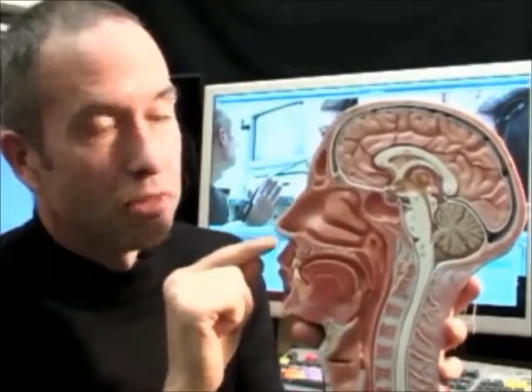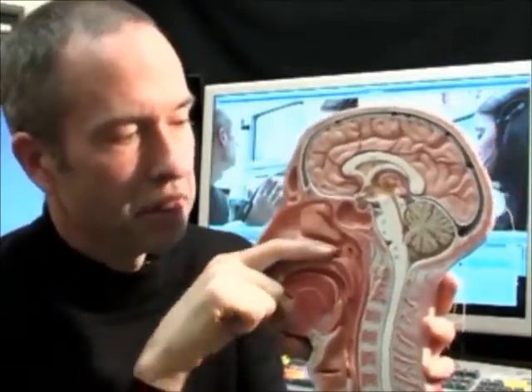Here's my buddy Bill. Bill's going to help walk us through a laryngoscopy. He's a half head. There you go. Anyways, what we're going to do with the flexible laryngoscopy is we're going to go through the anesthetized nose, and when the camera gets back to what's called the nasopharynx, the pharynx being this vertical tube here, it's going to turn 90 degrees and look downhill.